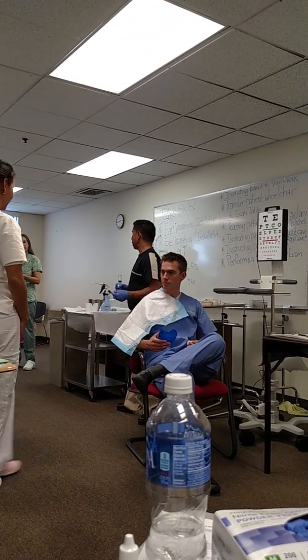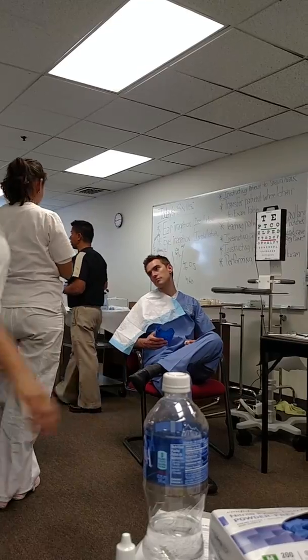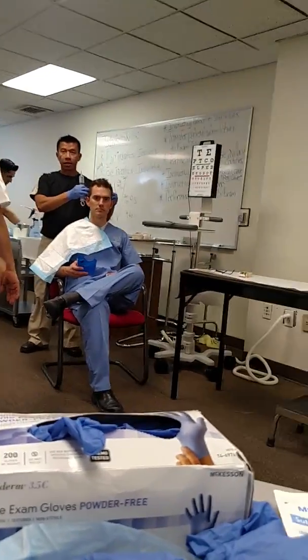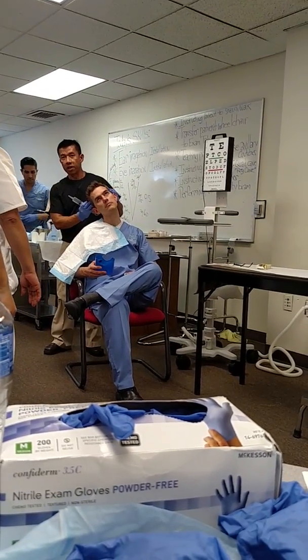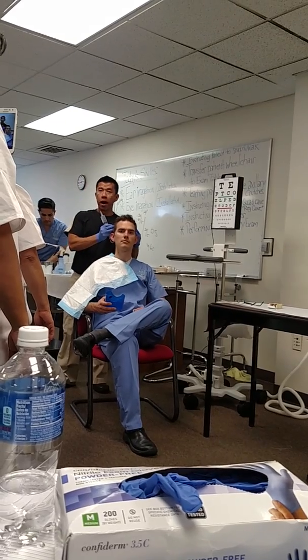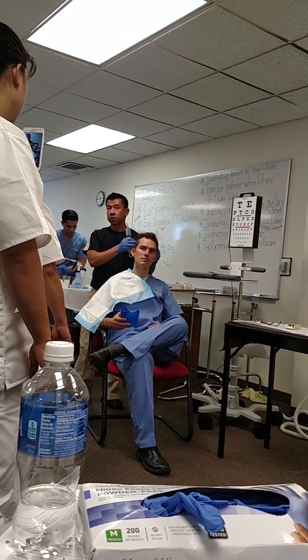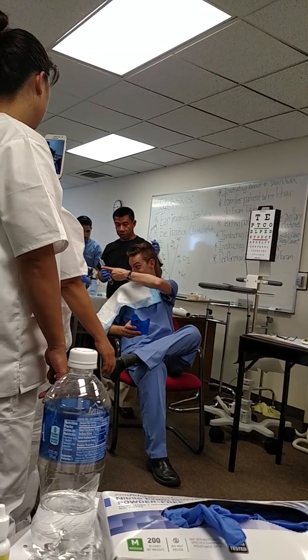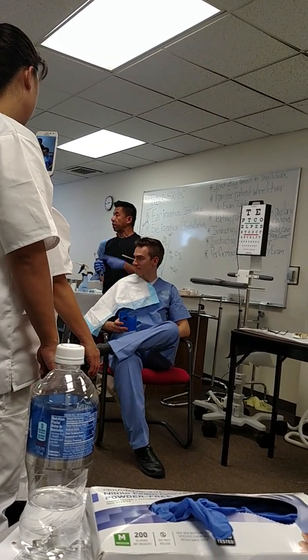For eye irrigation, you want to make sure that this is used for, for example, a foreign body or some chemicals. You will have the patient lean towards the affected eye. Are you guys following me? And why is that? So you don't get the contaminants from the other eye. Absolutely. So you will not have cross-contamination to the other eye.